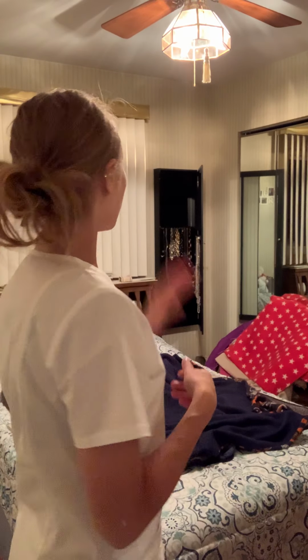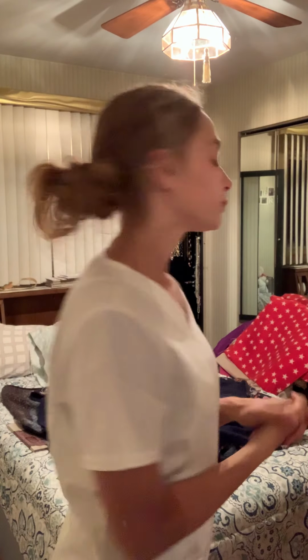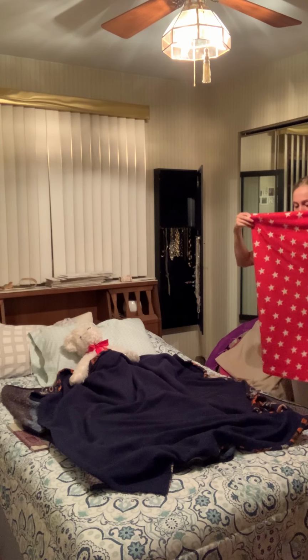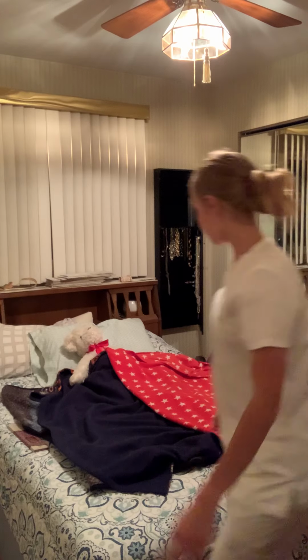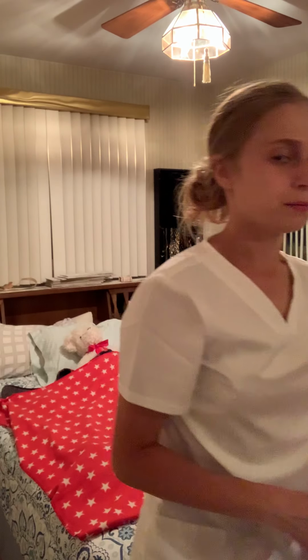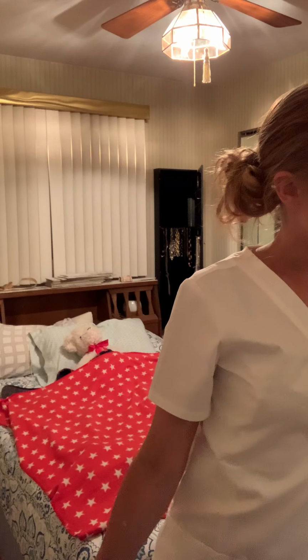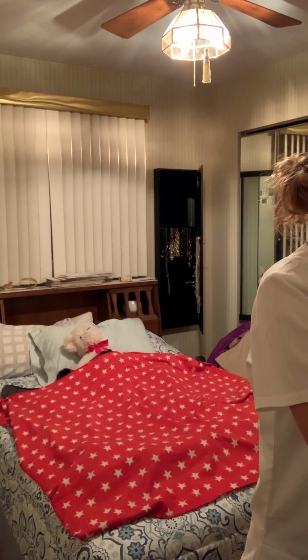Now we are going to get the blanket and unfold it. So we're unfolding the blanket. And then also just make sure the crease is in the middle, and it covers the person. The upper hem should be 6 to 8 inches from top of the mattress.